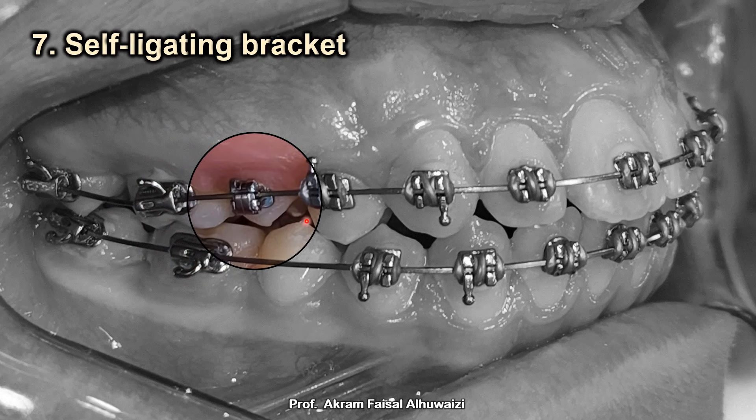Tip number seven: use self-ligating brackets on the upper second premolar. As we extract the four and retract the anterior segment back, we want the wire to slide through the five, six, and seven. For the wire to slide freely through those teeth it needs very little friction. A regular bracket with a ligature wire or elastic creates friction, so I prefer a passive self-ligating bracket on the upper five to minimize friction.